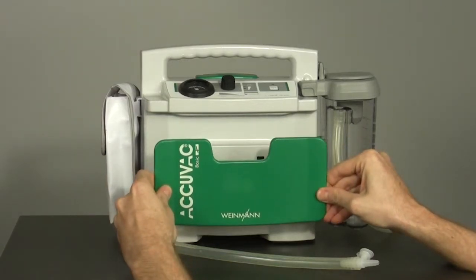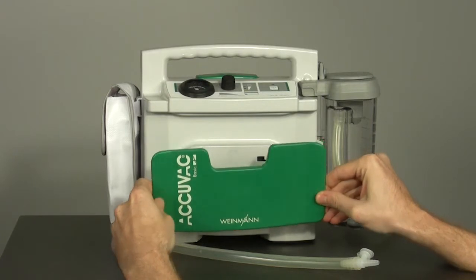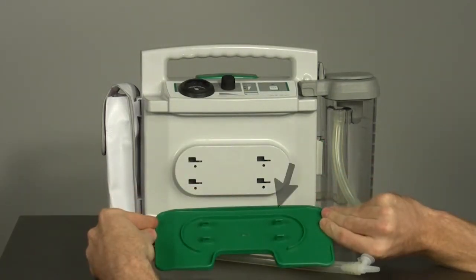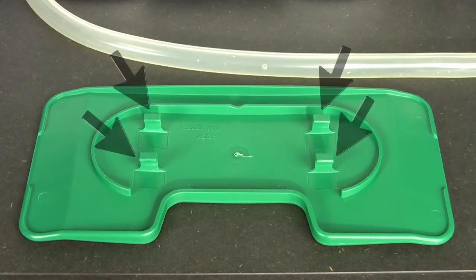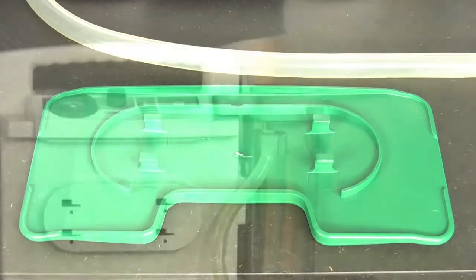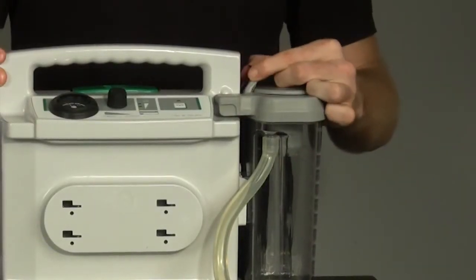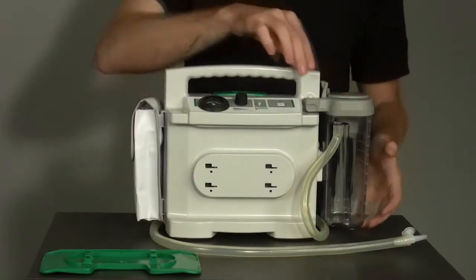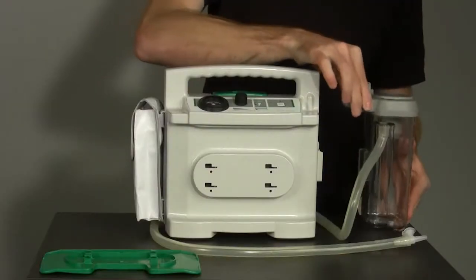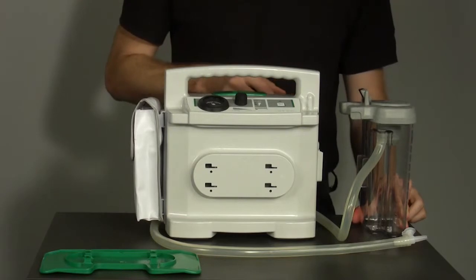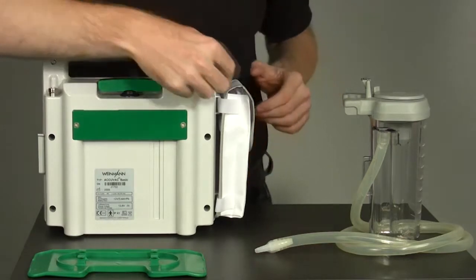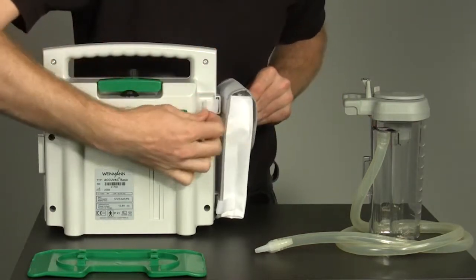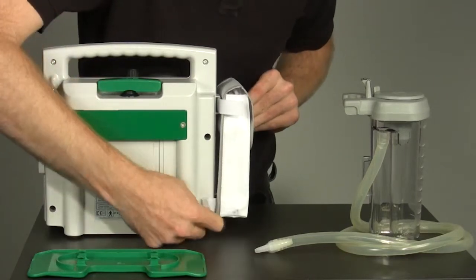Now you can loosen the tube holder plate from its anchor by pulling it toward you. Please note that there are four locating clips on the back side of the tube holder plate that keep it in place on the motor unit. If the locating clips break off, you will have to replace the tube holder plate. Disconnect the collection canister by pulling out the locking tab. Then you can push the closed canister upwards and out of its holder. The accessories bag is simply fastened to the motor unit with two Velcro straps. Open the Velcro closures and pull the accessories bag from the motor unit.